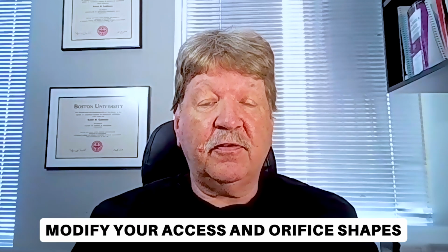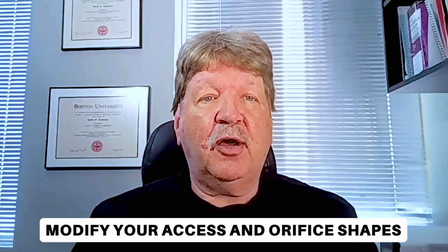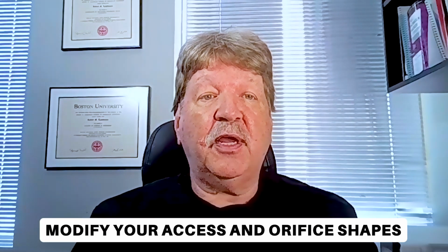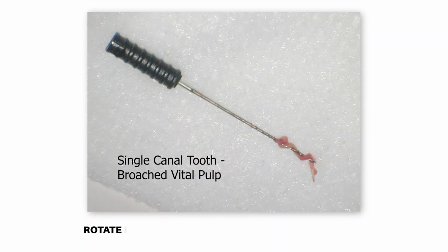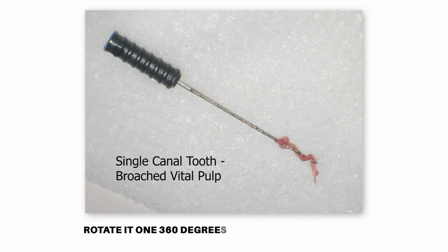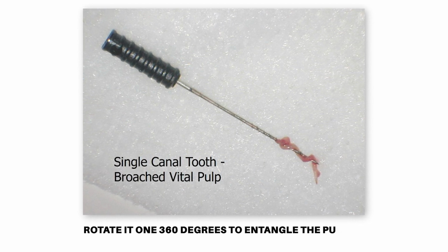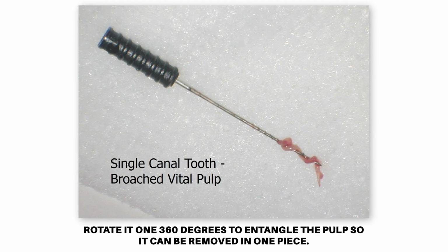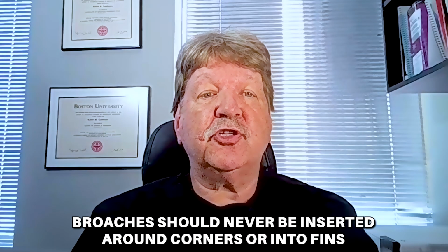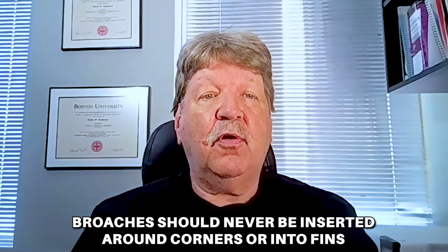If you can't place a broach directly into your canal space, stop. Modify your access and your orifice shapes to allow for smooth, direct entry of the broach into the canal orifice. We need to insert the broach roughly 2/3 into the canal and then rotate it approximately one 360-degree complete turn, entangling the pulp in such a way that the pulp can be removed in one piece. Broaches should never be inserted around corners or in fins.